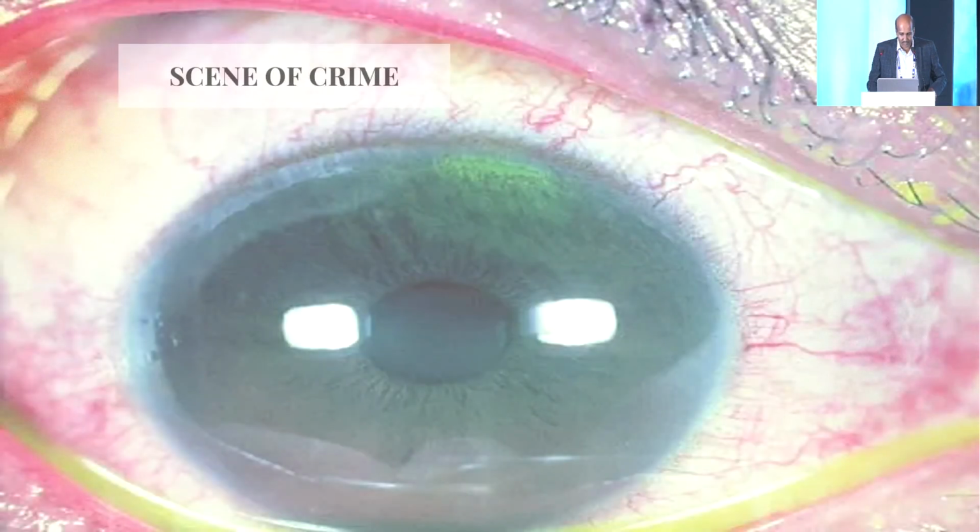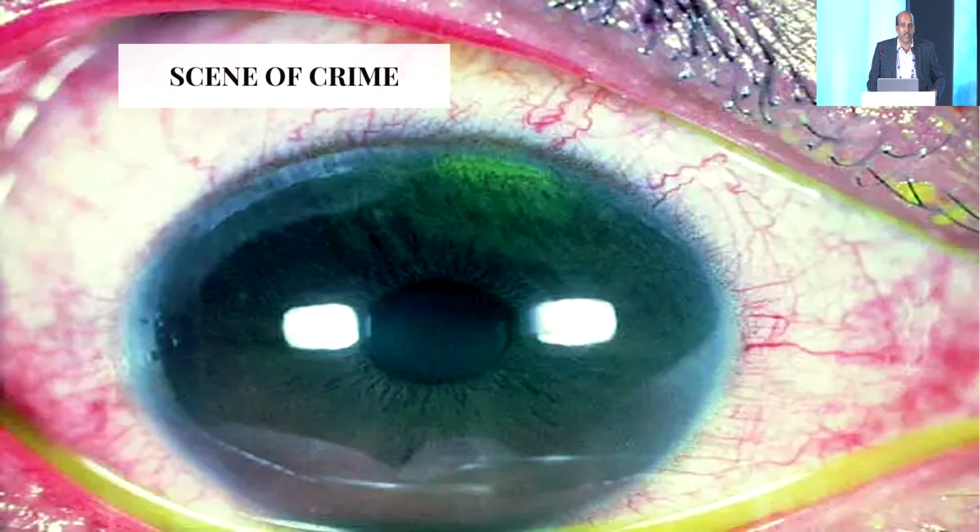Then something like an insect head or an impacted foreign body on the conjunctiva, sometimes even vegetable matter, would not come out with a cotton bud, and you may have to use some forceps to take it out under topical anesthesia. And always try to remember that whatever you do, at the end of the process you should always stain the cornea and the ocular surface with fluorescein.